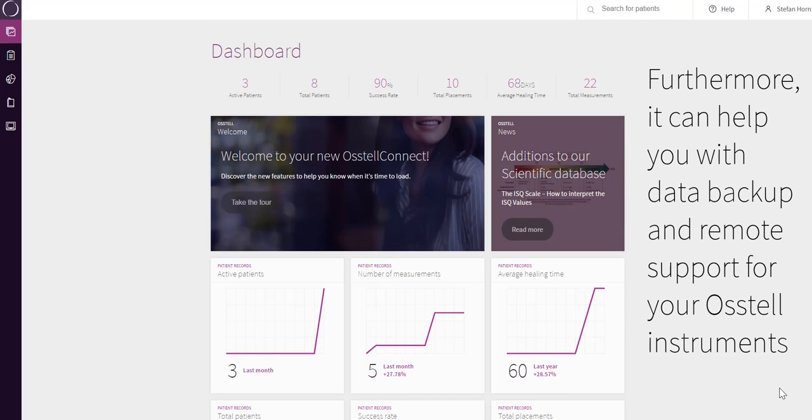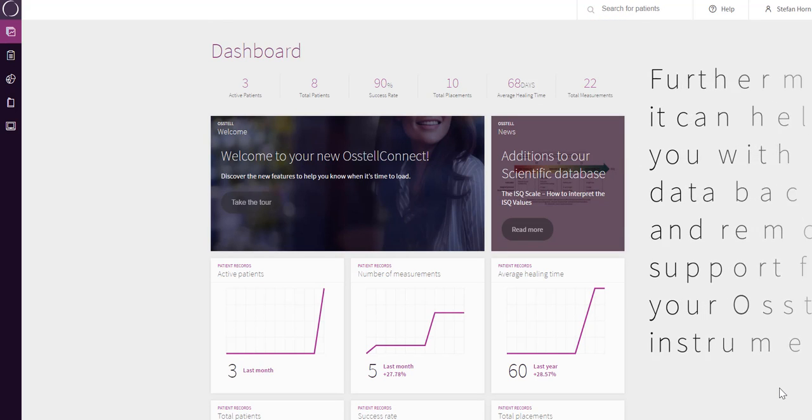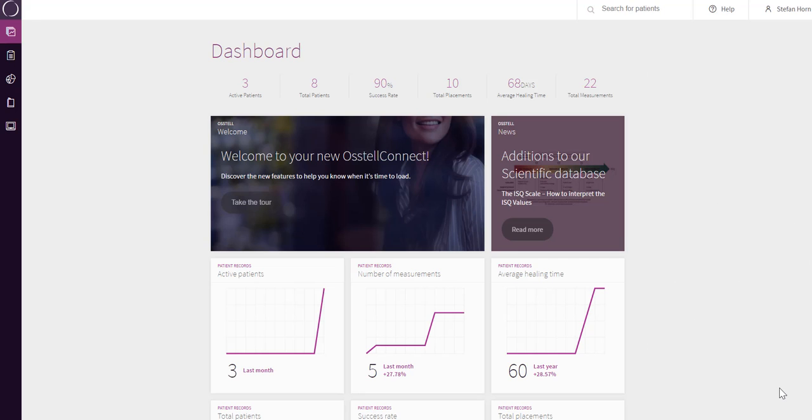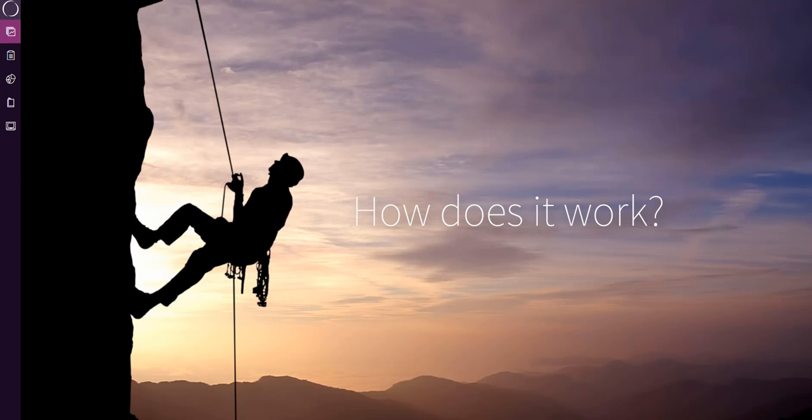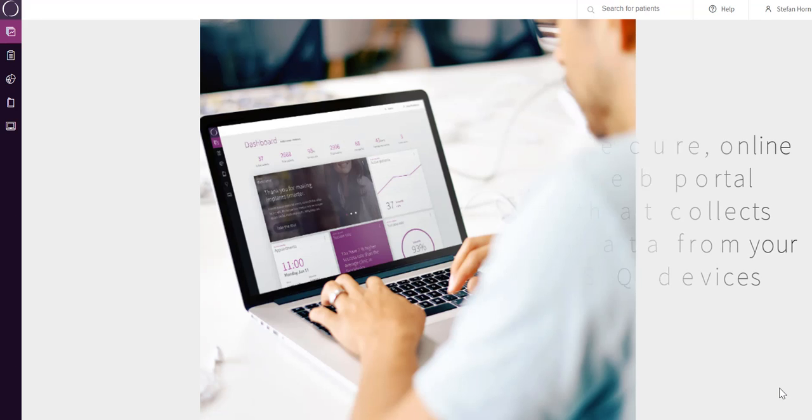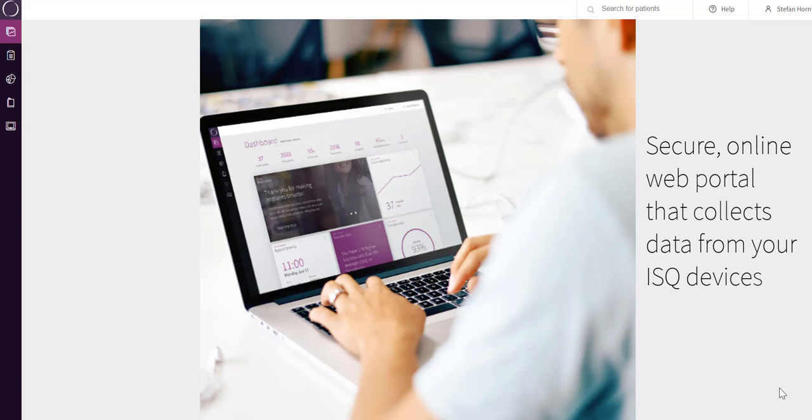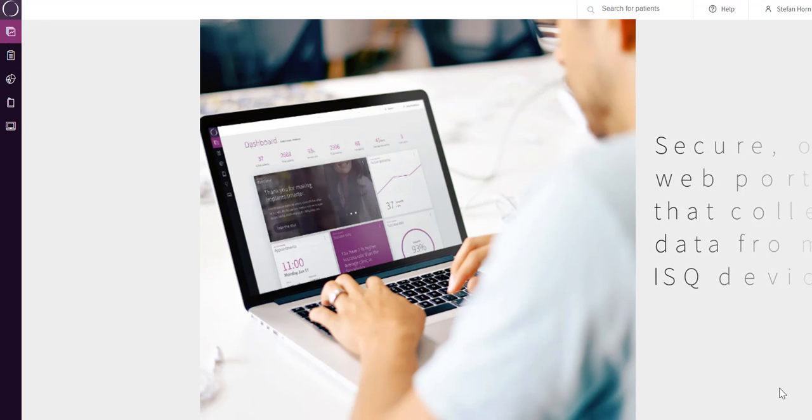Furthermore, it can help you with data backup and remote support for your Osstell instruments. How does it work? It is a secure online web portal that collects data from your ISQ devices.